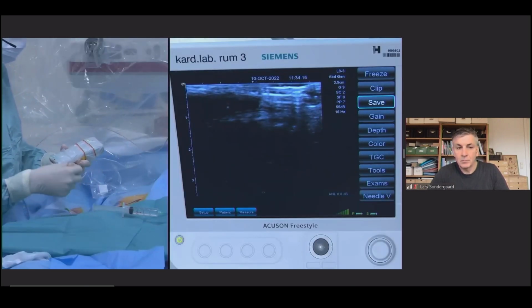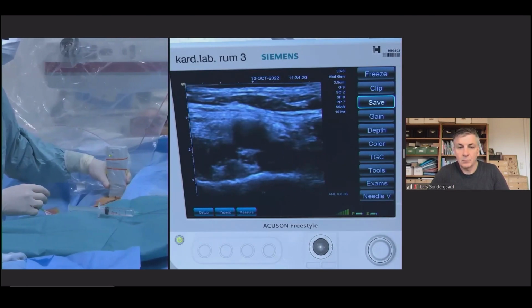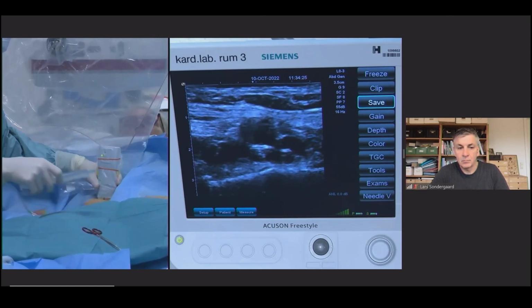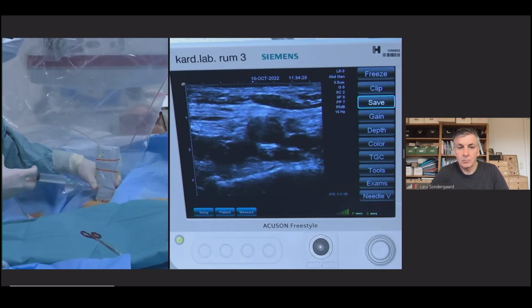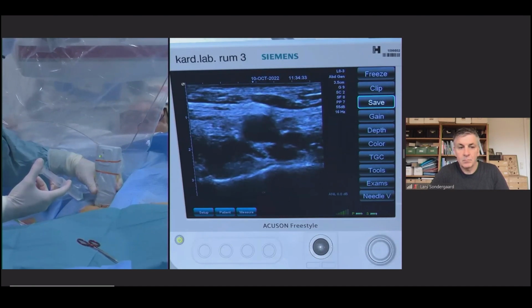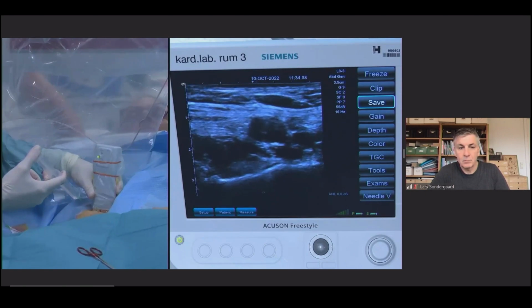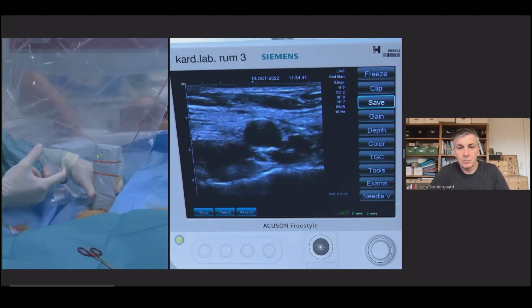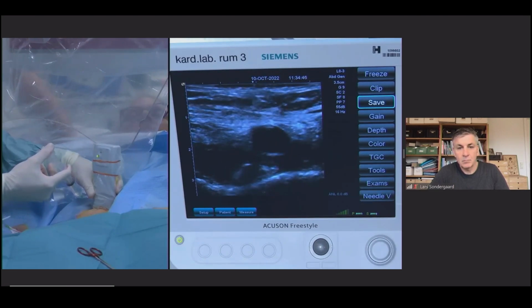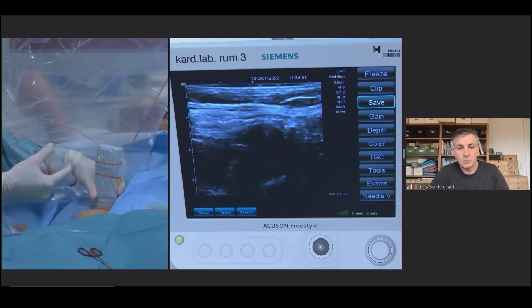So I think this is now state of the art for vascular access, to use ultrasound guided puncture. It's going to give you a better chance to have a good access in the middle of the artery in a position where you have no calcium, and thereby the chance that your pre-close system is going to work is higher. So you can see here Ole has identified the common femoral artery, and he's now putting some local anesthesia in, and he can also use the ultrasound to guide where actually to position it just above the vessel.